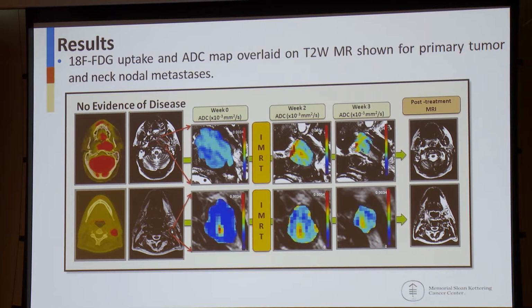So increasingly what we're seeing, certainly in this session, is the functional imaging methods coming in as a complementary method to simply looking at tumor size using anatomy. There are a number of different ways of looking at tumor response. Some are without contrast, such as diffusion weighted imaging, but also some contrast-enhanced techniques, such as DCE MRI, where we inject gadolinium and look at how the contrast moves from the vasculature into and out of the tumor, and look at the vascularity of the tumor and how that changes in response to chemotherapy, for example.